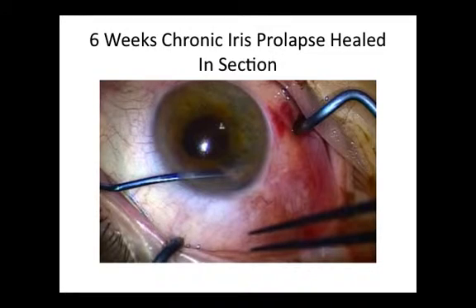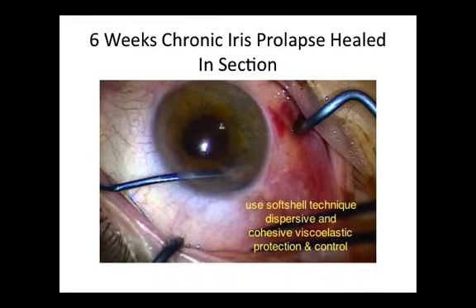When managing this condition, it is always important to fill the anterior chamber with viscoelastic. I would usually use a soft-shell technique — that is, a combination of both dispersive viscoelastic to protect the endothelial cells and cohesive viscoelastic to provide the best protection, good working space, and control of the iris tissue.